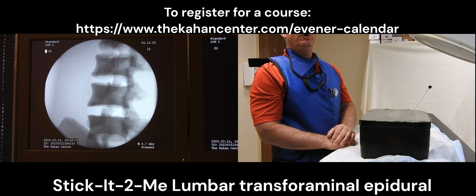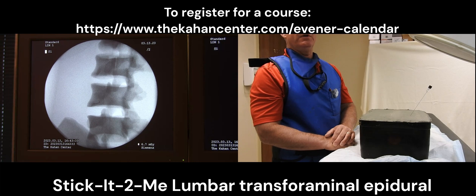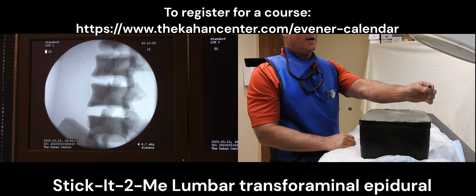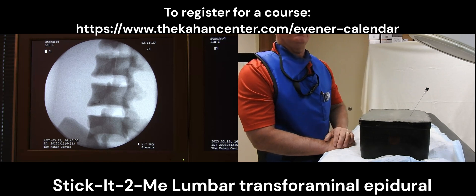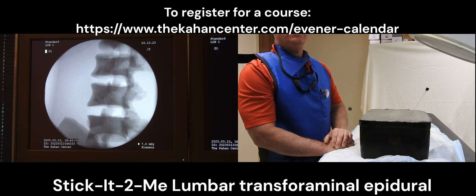As we know, the needle will curve away from the notch in the hub. As you can see, I'm enhancing my needle trajectory by placing a curve, and with this current curve the needle will go superior in the neuroforamen. Thus at this current time I'll rotate my notch 180 degrees and then advance the needle into our interventional spinal training model, and you will see that our needle will start to straighten out.